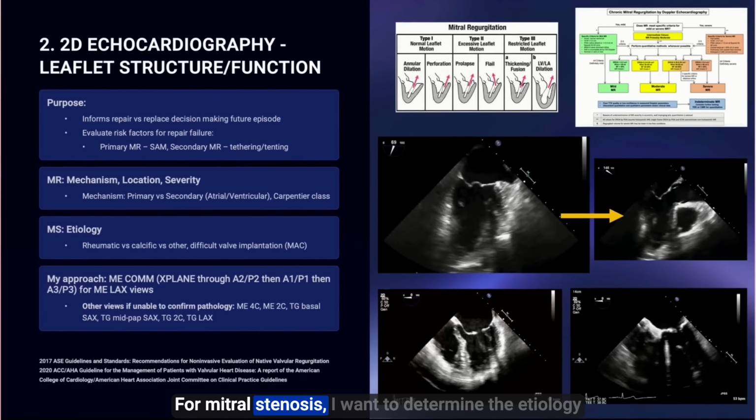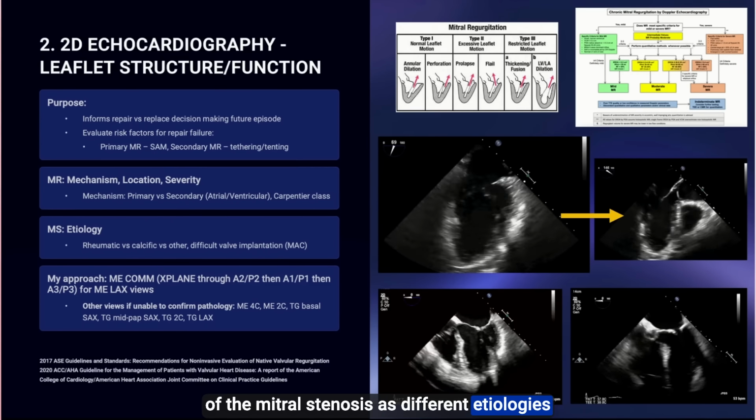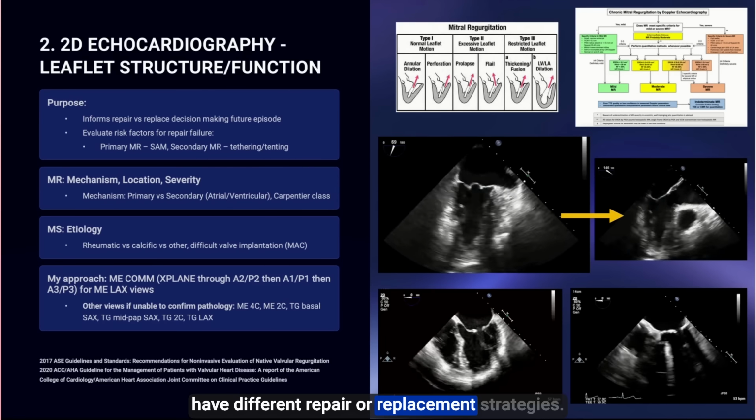For mitral stenosis, I want to determine the etiology of the mitral stenosis, as different etiologies have different repair or replacement strategies.